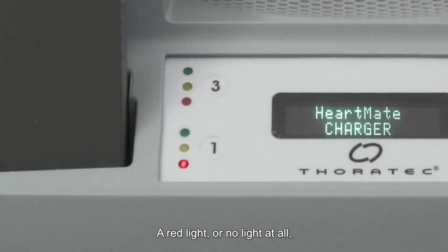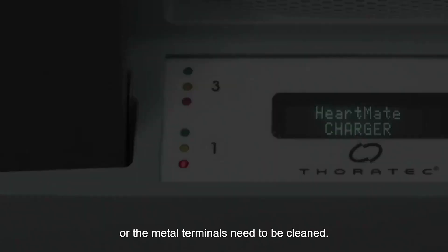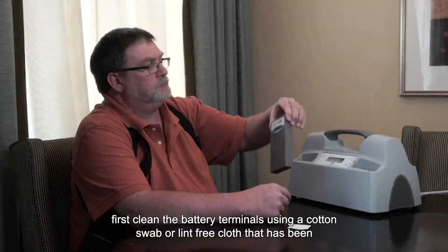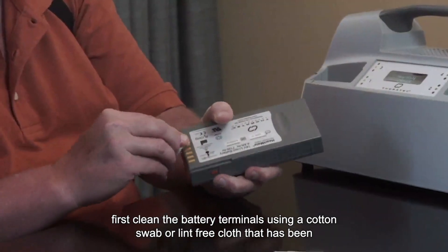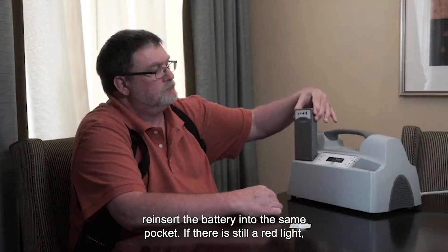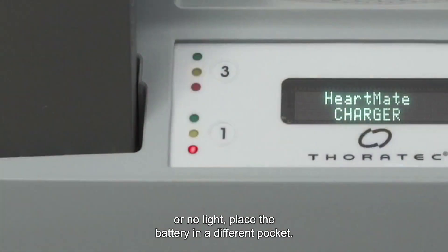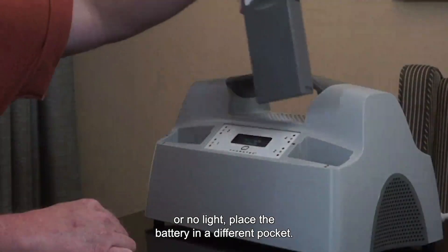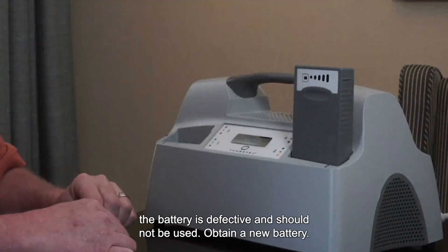A red light or no light at all means that there is a problem with the battery, the charging pocket, or the metal terminals need to be cleaned. To fix this issue, first clean the battery terminals using a cotton swab or lint-free cloth moistened with rubbing alcohol. After the alcohol has dried, reinsert the battery into the same pocket. If there is still a red light or no light, place the battery in a different pocket. If the same condition still persists, the battery is defective and should not be used. Obtain a new battery.